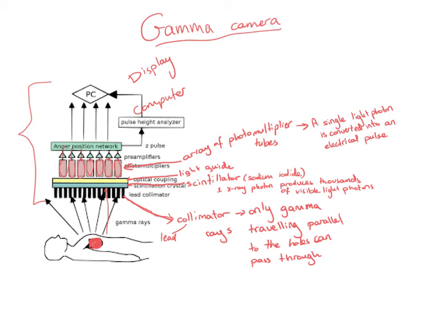And also to add here, gamma cameras are actually very helpful to diagnose patients without the need for surgery. However, they are still exposing people to ionizing radiation, which is not good for you. And even though they're cheaper than PET scans, they're still expensive. So it's not something that can be easily done for a lot of patients.